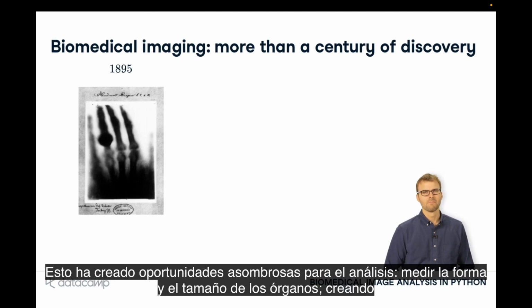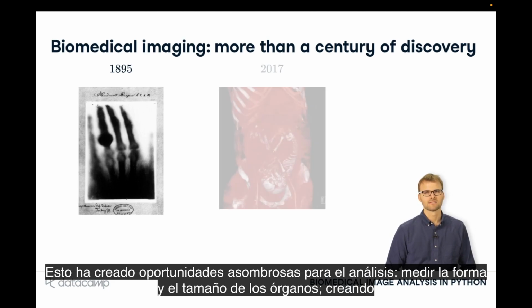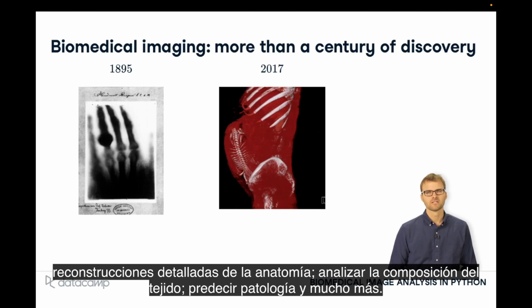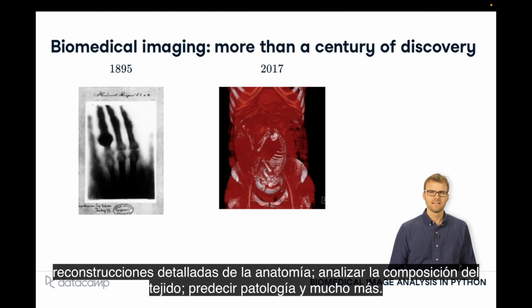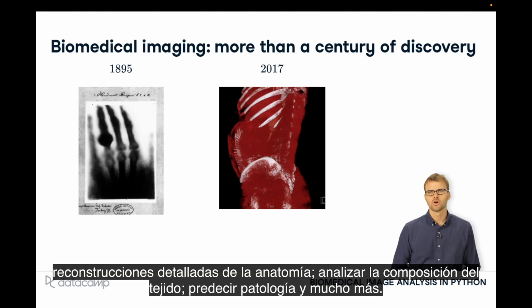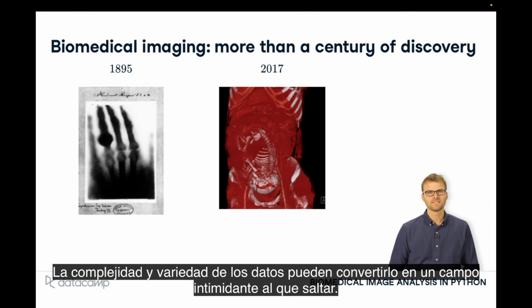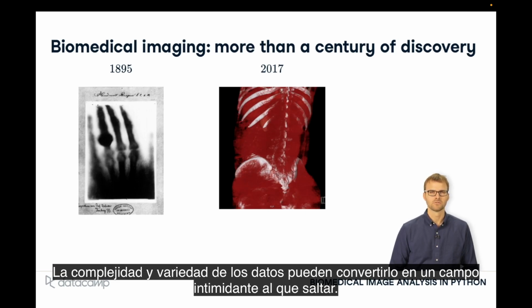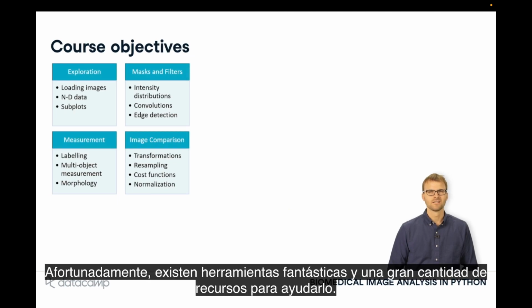This has created amazing opportunities for analysis: measuring organ shape and size, creating detailed reconstructions of anatomy, analyzing tissue composition, predicting pathology, and so much more. The complexity and variety of the data can make it an intimidating field to jump into. Fortunately, there are fantastic tools and a wealth of resources to support you.